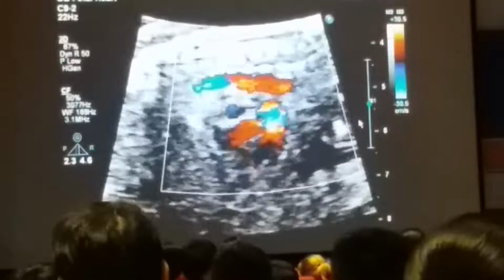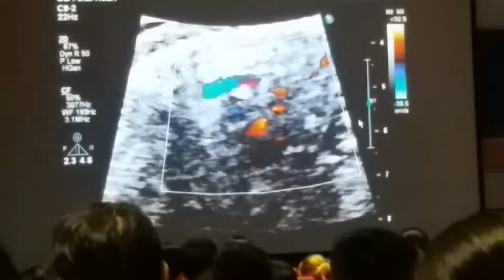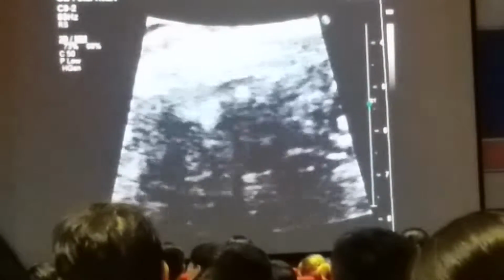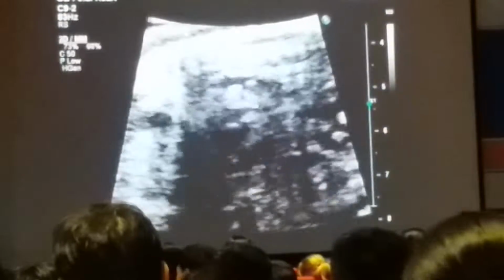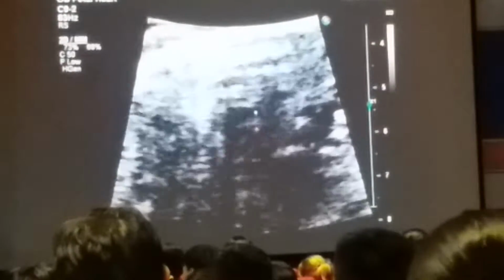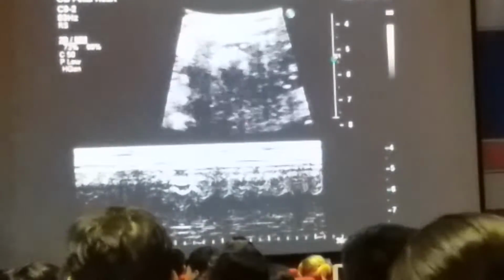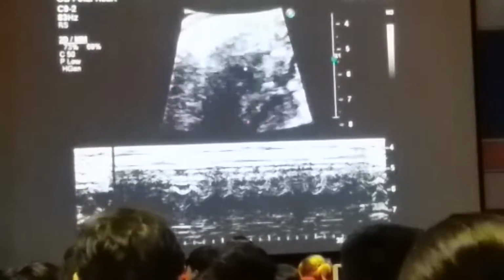There's the aortic valve. If you just do an M mode over here, do we have M mode here? There you go. It doesn't say M mode on it. How am I supposed to know it's M mode? Okay, do you see this little box there in the middle? Watch when we go M mode. Now you did it again, right? Oh boy, that's great. No, now we've lost it.